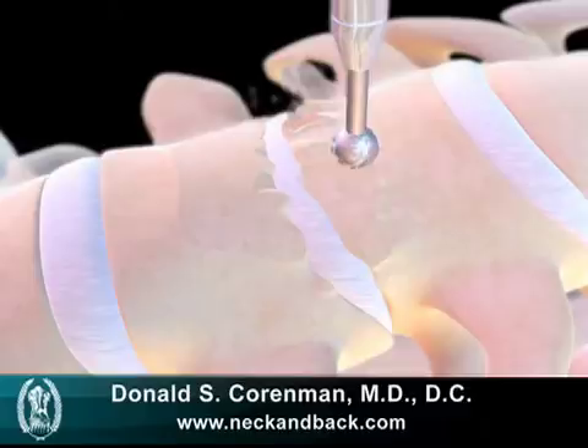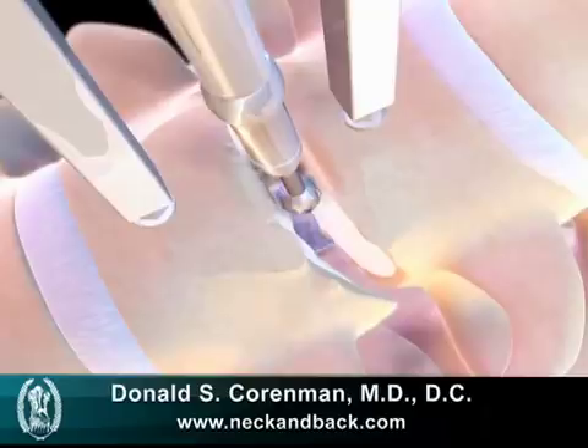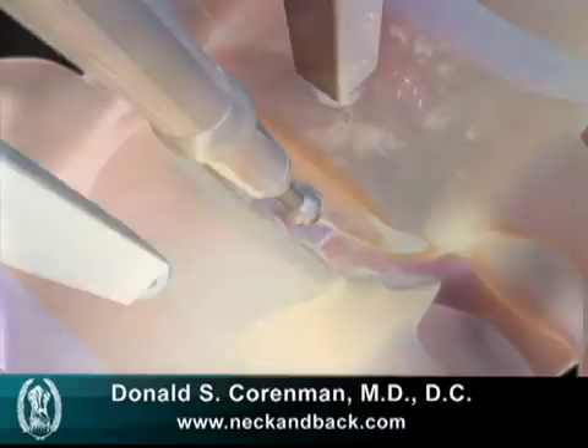Once we have the spurs in the front removed, we then need to remove the spurs that occur within the disc itself. We see this little Dremel-type device, the burr, removing that bone, and here we see a live version of the same thing where the burr actually takes the spur off the bone.